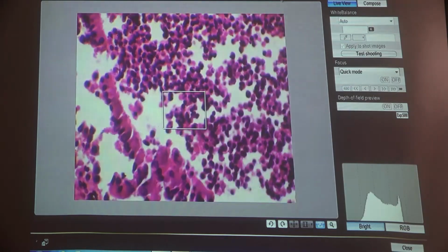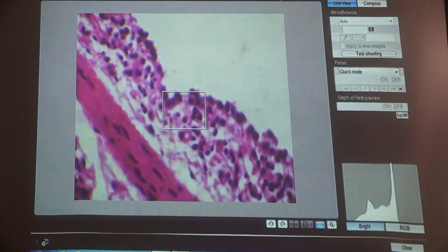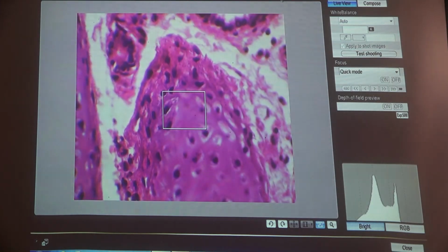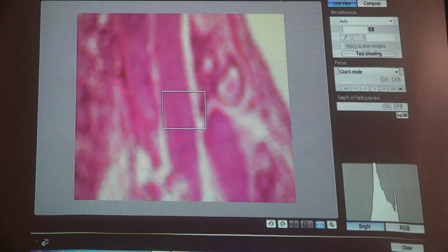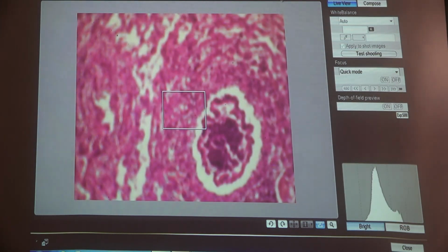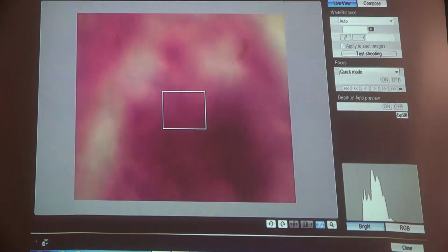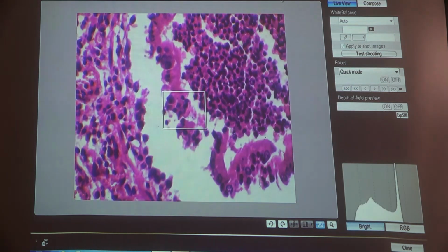These are the pus cells, in addition to many aggregate of the bronchioles with acute pus cells, with acute inflammatory cells, like this. Neutrophilic aggregation.